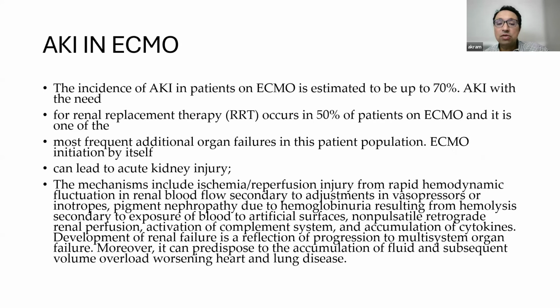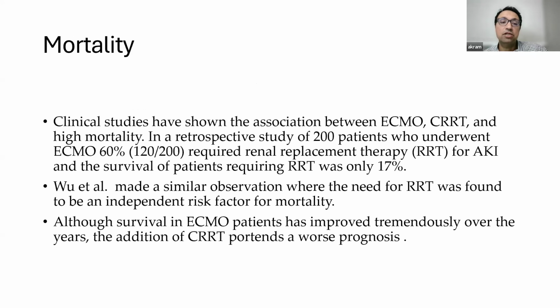Acute kidney injury on ECMO happens in 70% of patients, and 50% of patients need renal replacement therapy. Usually it's either due to the original disease or secondary to the ECMO itself, where hemolysis occurs and an inflammatory response, and of course non-pulsatile flow, result in acute kidney injury.